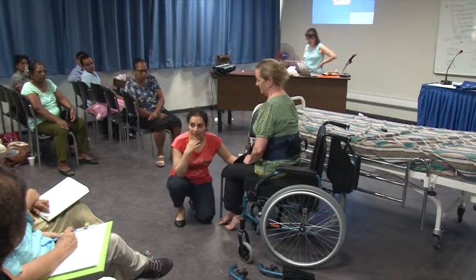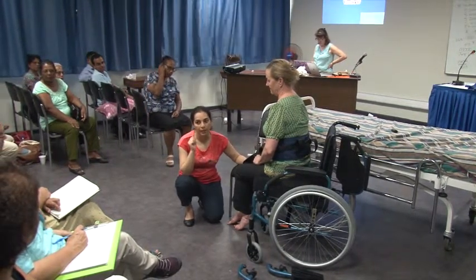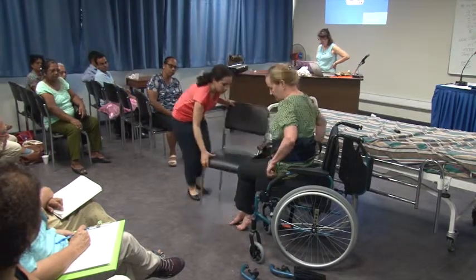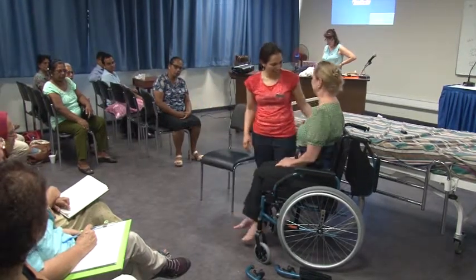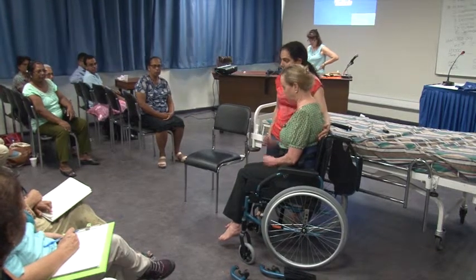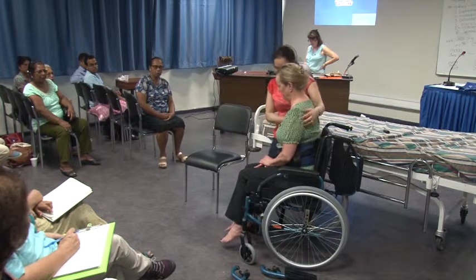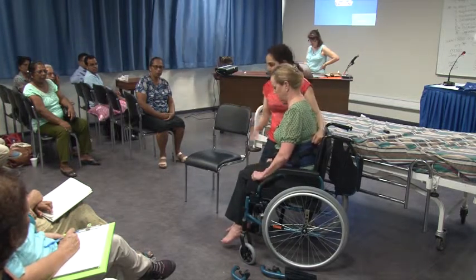If we're going to stand her, that's a different thing. We have to guide her, and I would suggest 2 people do that. But again, there may be situations where they can stand out. So if you can get in the chair, you are good. I want to help her to stand, but I don't have anywhere to hold on, and I don't want to be pulling her arms. She can stand, but she just needs a little bit of a push, okay?